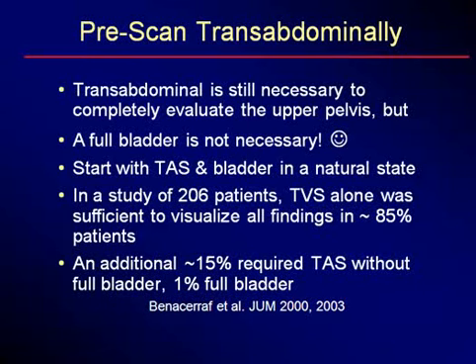So if a patient comes with an empty bladder and happens to be in this very low percentage that she would need a full bladder, we will then have her drink and fill her bladder. This may happen, for example, in a very young girl, a virginal patient, a very old patient who cannot tolerate a transvaginal exam. But that will only be a very small percentage of patients that have to sit and wait and fill their bladders.